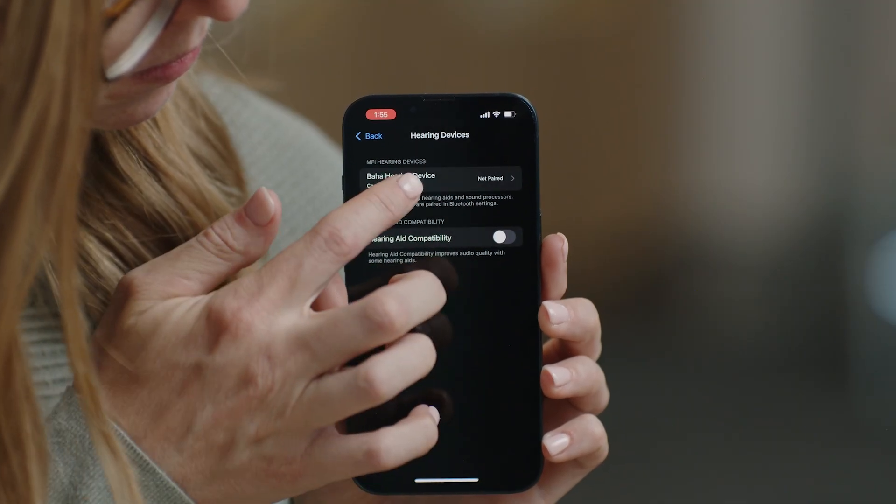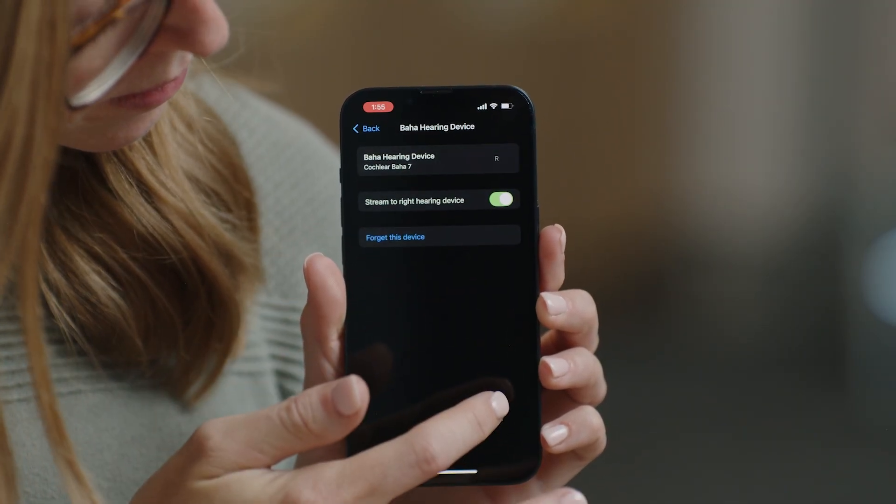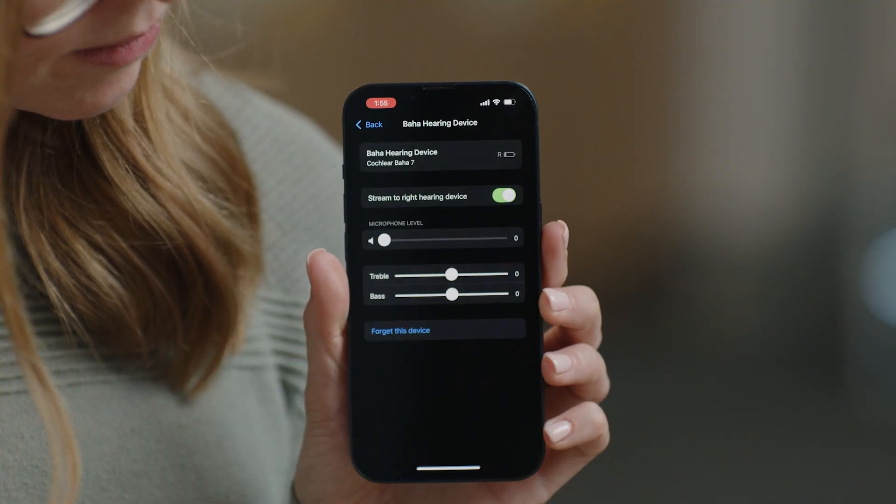Turn your sound processor back on by closing the battery door completely. When the name of your sound processor shows up on your phone, select it and tap Pair. Once successfully paired, the processor will beep six times, followed by a ripple tone 20 seconds later. Once paired, simply begin playing audio from your phone to stream directly to your Baha 7 sound processor.